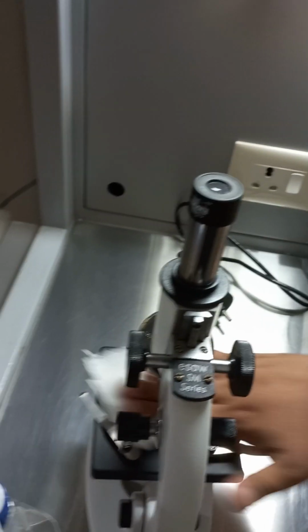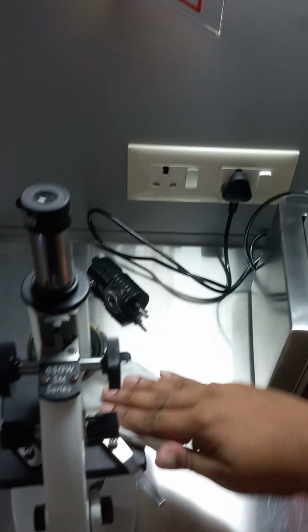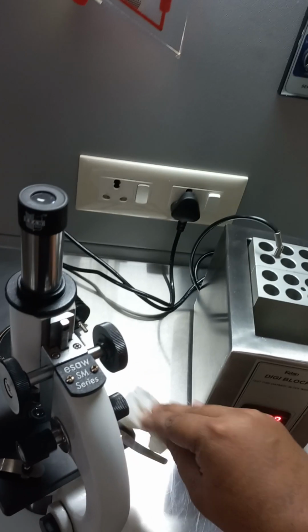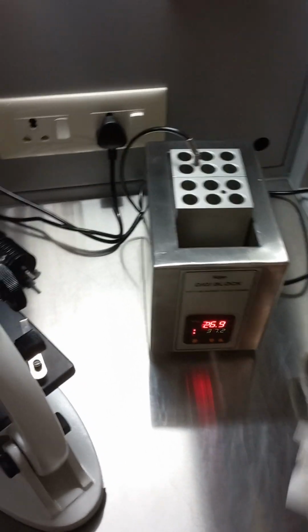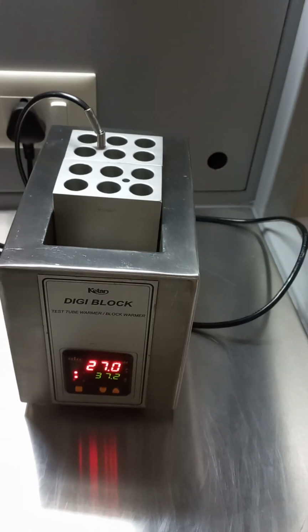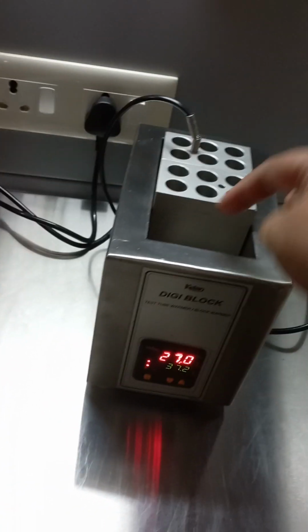And this is our simple microscope. No need for expensive hi-fi microscopes just for IUI sperm preparation, because we have already seen the sperms very well on our high-end machines. I generally also tend to see most of the specimens on my own and decide whether IUI will work for them or they require ICSI or IVF or whatever. So definitely this is a good way of going ahead. You can see over here, this is the set temperature and this is the present temperature. Slowly with time the stage heats up inside and this heats up the blocks.